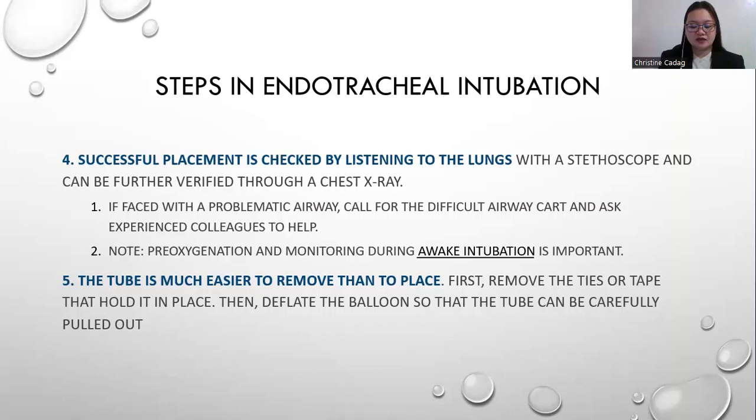This is to prevent desaturation of the patient, especially if the patient has experienced difficult intubation before, or if, for example, there is some structure in the throat that makes it difficult for the doctor to intubate the patient.